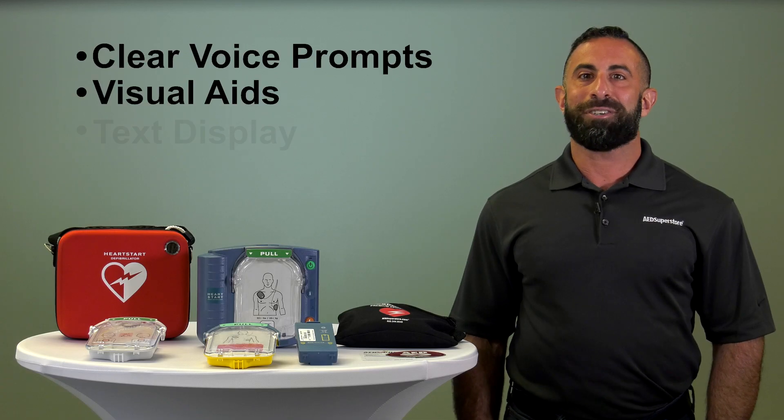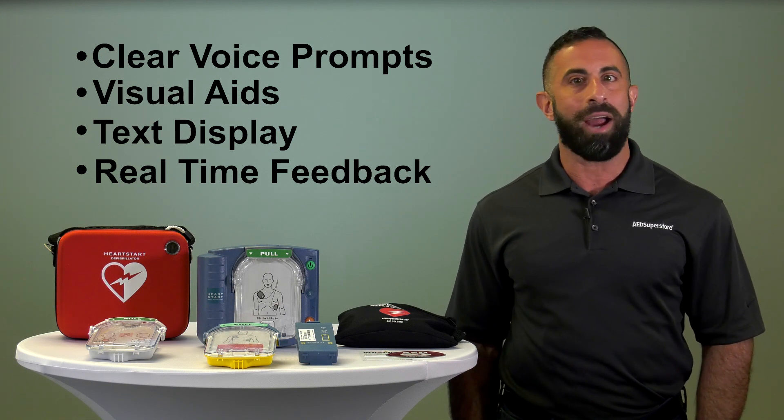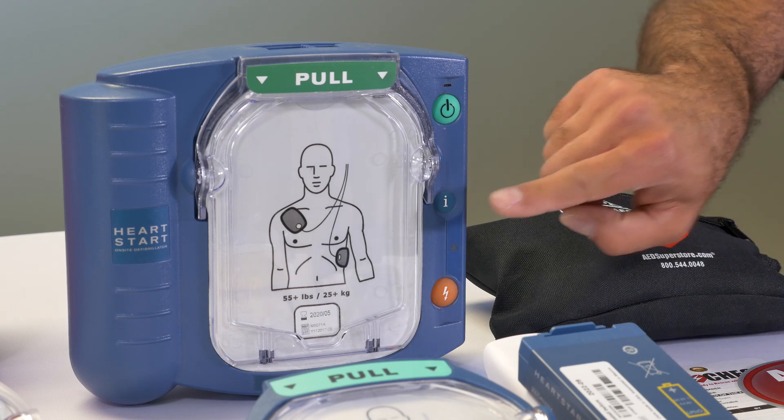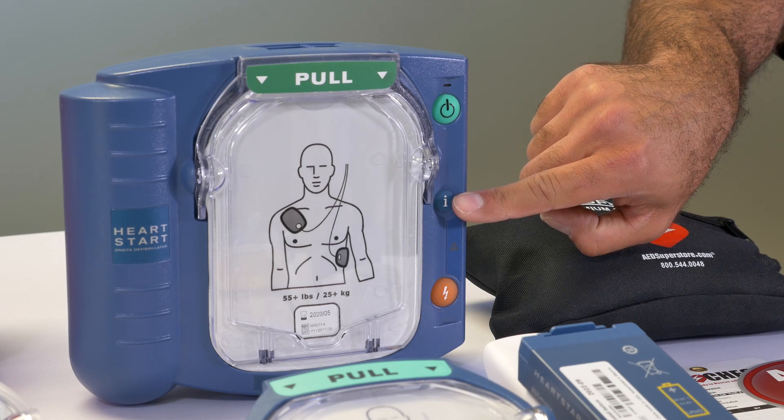The Philips HeartStart Onsite is the only AED in the U.S. where there is no prescription required. Some of the features include pressing the I button to receive unit information or CPR coaching during a rescue.